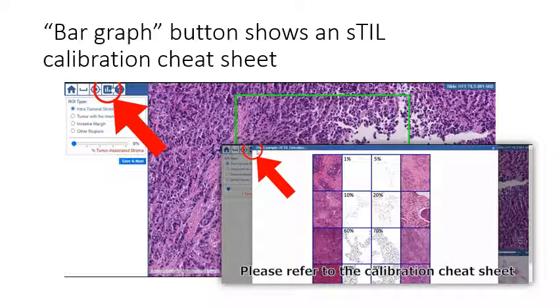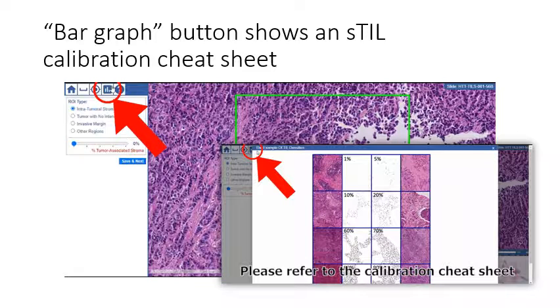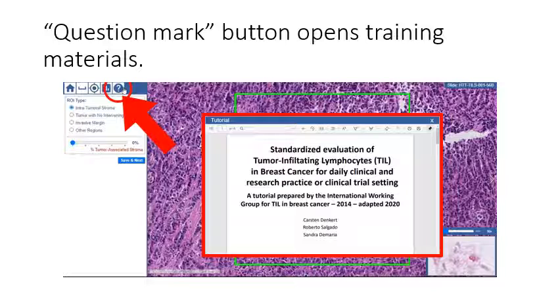CA microscope offers you many tools to help you as you annotate. First, selecting the bar graph button will show you a calibration cheat sheet. Please refer to it as needed while annotating. Second, selecting this question mark button will open a presentation on how to evaluate TILs. You can review it or refer to it while annotating.